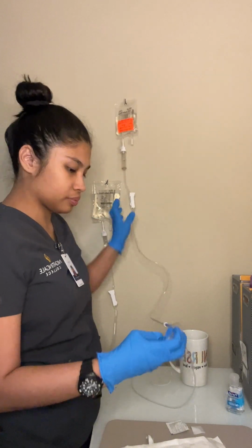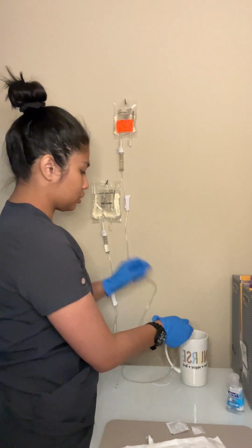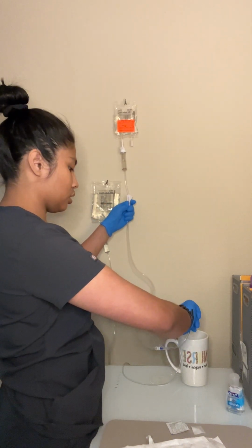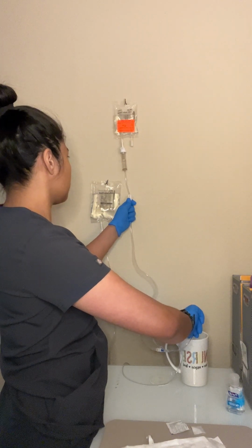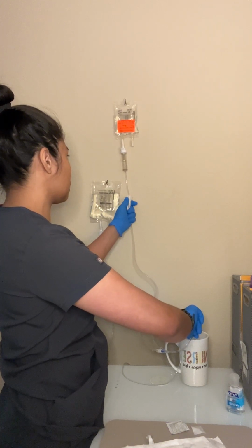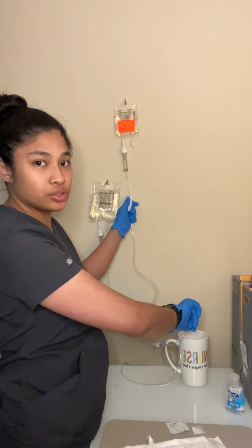So same, you want to unclamp. Take the cover off. And making sure that the drop rate is correct, counting every drop in a full minute. The patient is to receive the medication at 100 drops per minute.